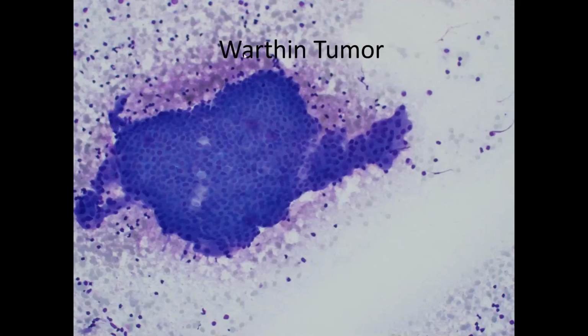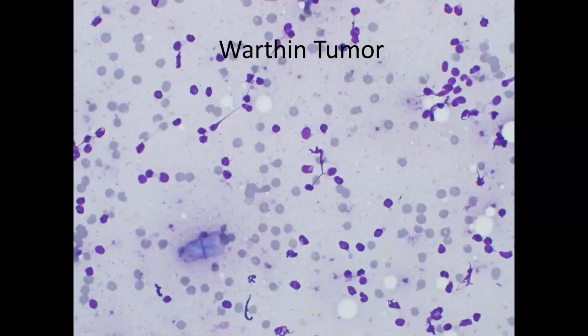The other two features that you'll see to varying proportions are going to be lymphoid cells, either in the background or percolating through these sheets of epithelial cells. So lymphoid cells either in the background or in association with the epithelial cells. And finally, you want to see grungy, granular, cystic debris in the background. So that grungy cystic background, the lymphoid cells, and the epithelial component. Those are the keys for a Warthin tumor. Again, you can see in this slide lymphoid tangles, loose individual lymphocytes, as well as this very granular smear background. Those are the key things for a Warthin's tumor.